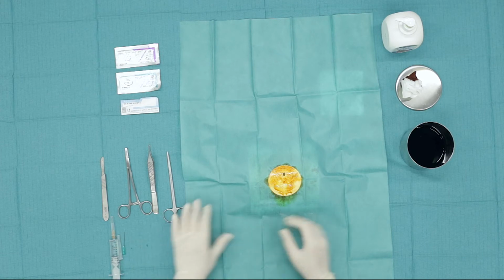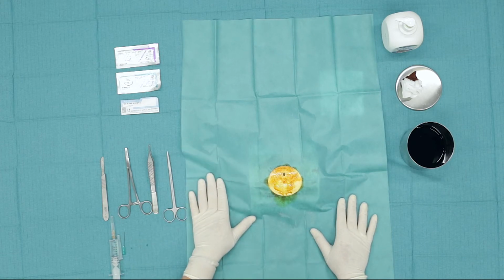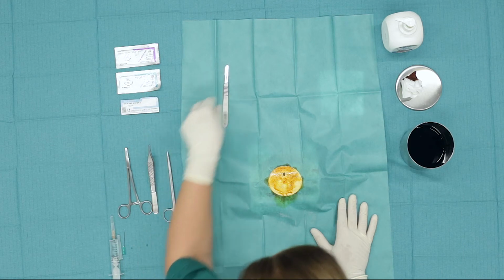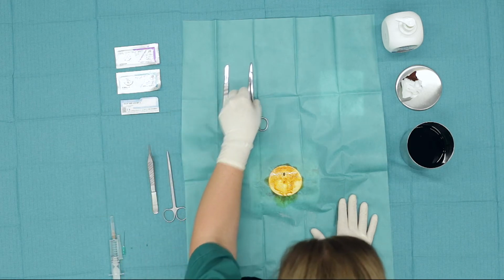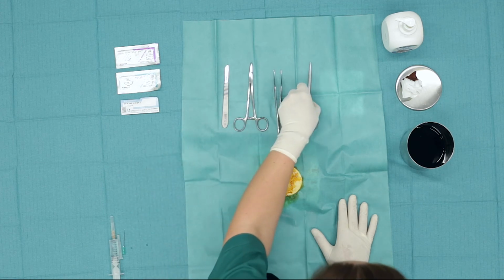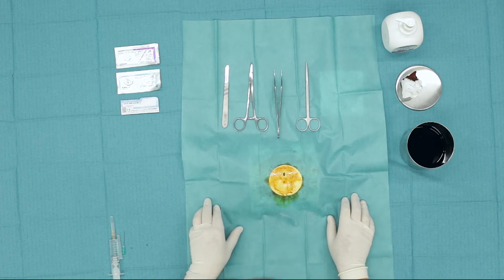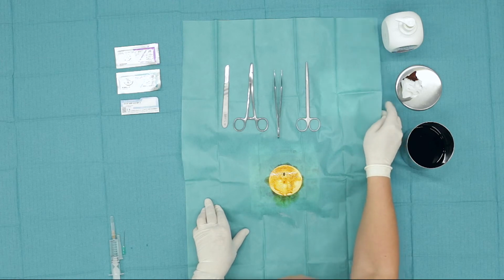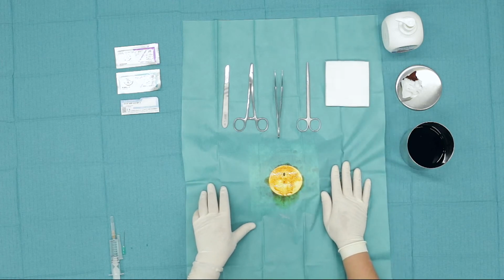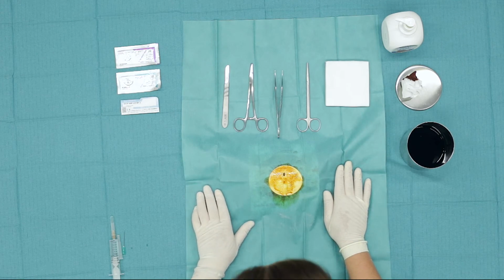During the actions of the anesthetic preparation, we place in the surgical field that we have created the scalpel, the needle holder, the surgical forceps, and the scissors. These are necessary tools to proceed with the removal of the skin formation. We need gauze that is sterile, and we need stitches.